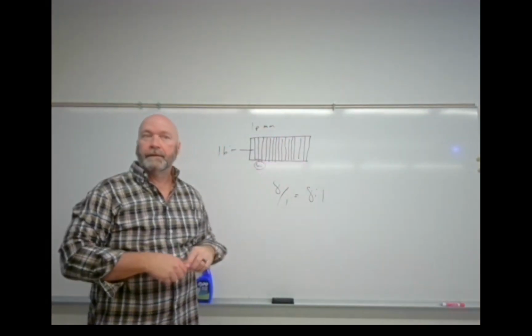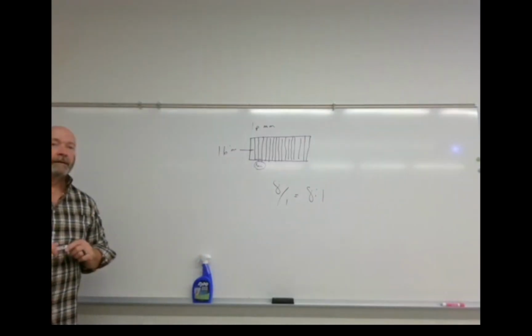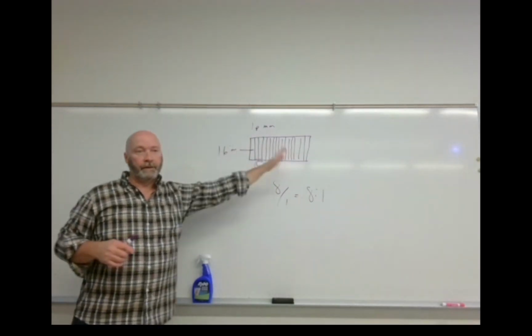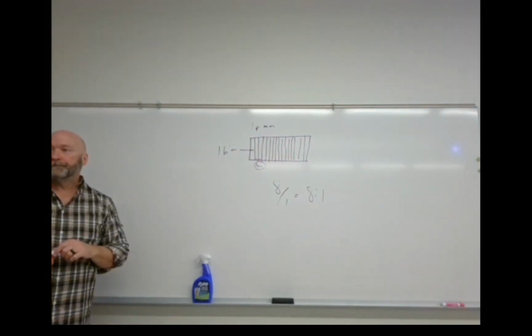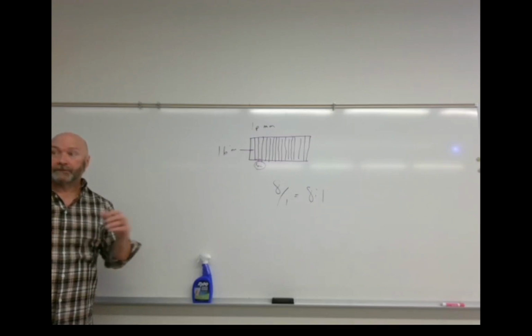Wait, would that be the ratio? The grid 16 to 1? Yeah. Well, but it's the same height. Yeah, I didn't change the height. All I did was add more grid strips. I doubled them. So, sorry, my brain, it might be limited by what I'm seeing. Did it get wider or just more compact? No, just more compact. Okay.